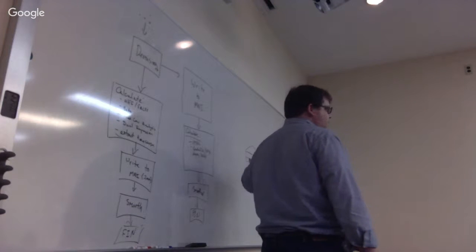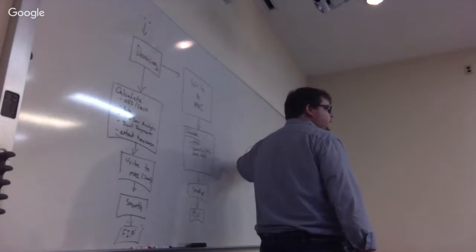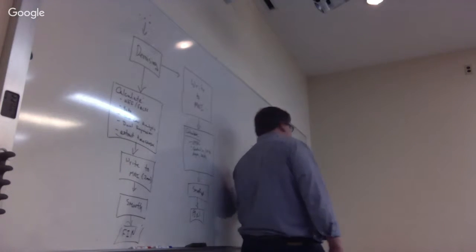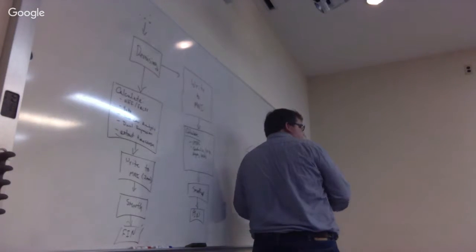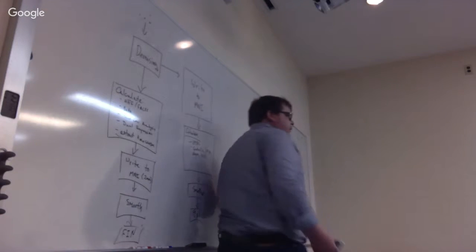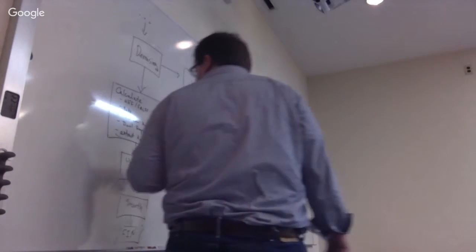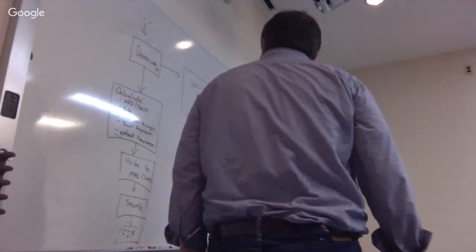We can make it smaller. We can make it just the 8 cube, so it's just the centers and not all that. Yeah, just the first neighbors, right? And those are settings there. But the point is if you smooth, if your FWHM is smoothed to this level, then ReHo means absolutely nothing, right? So then you might want to expand the cube or something, right? Essentially, that's a good one where you don't want to, you know, maybe fALFF and ALFF would be a little bit different, right?